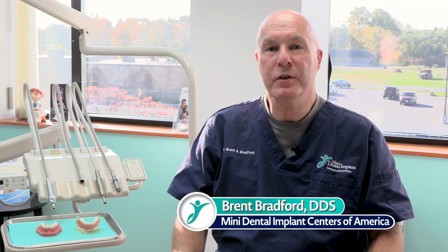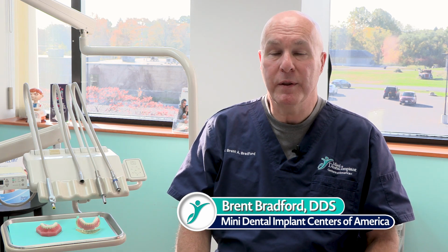If a patient presents to us that is missing multiple teeth, again, we will do an examination of the area, make sure that the gum tissue is healthy, and we're going to take what we call a CBCT scan, so we can get a 3D image of the bone in those areas to determine how many implants we need to place and in what location we need to place those.